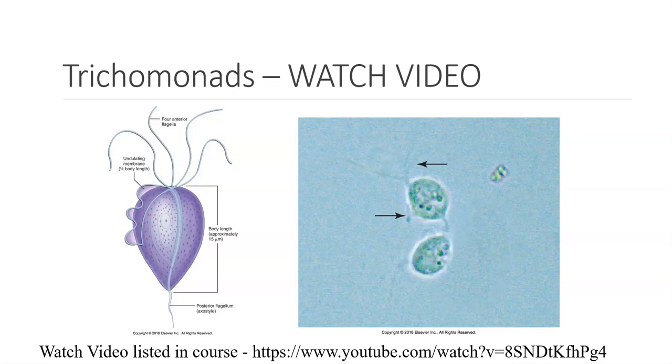On the left you see a line drawing that shows you the 4 anterior flagella, the undulating membrane, the size of the body, and then a posterior flagellum. The picture on the right points out the barely discernible flagella, and in the middle of the Trichomonas is the undulating membrane. Again, it's very difficult to see, and that's why it's important that these be living, because they have very characteristic appearance and movement.